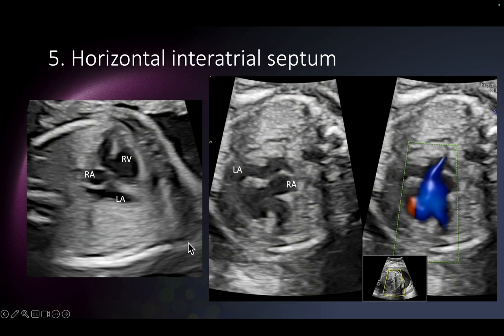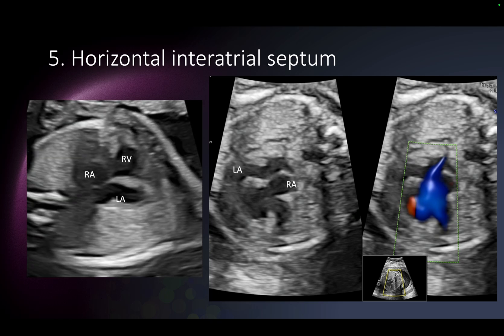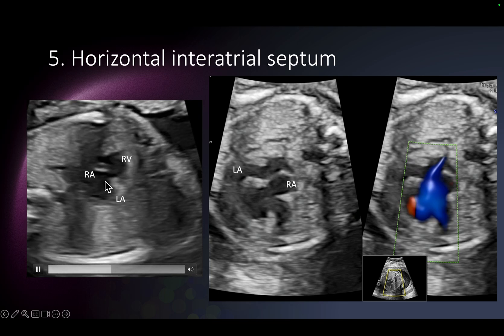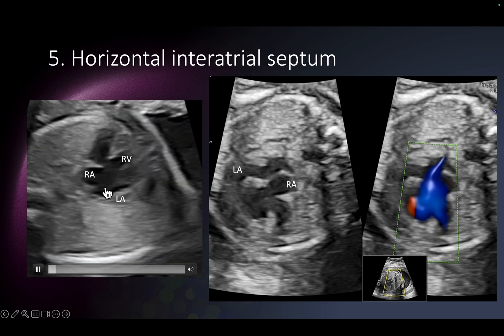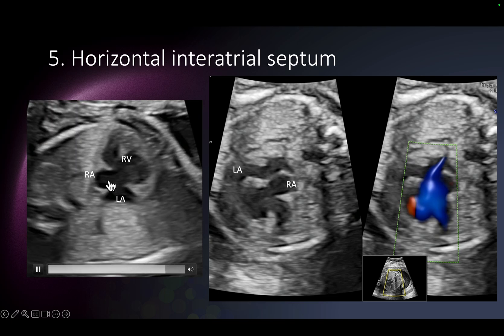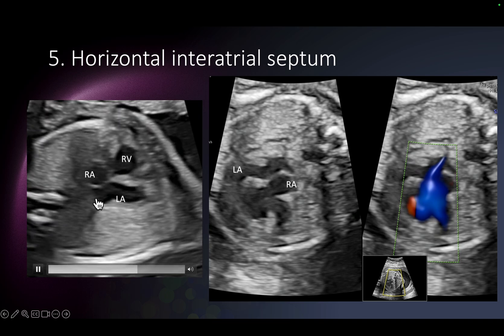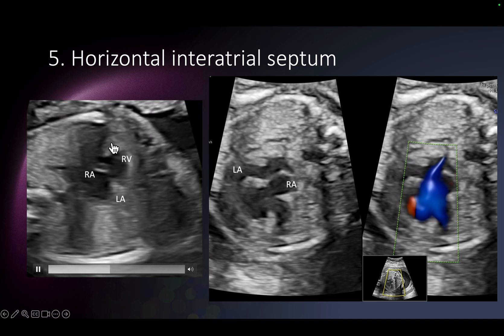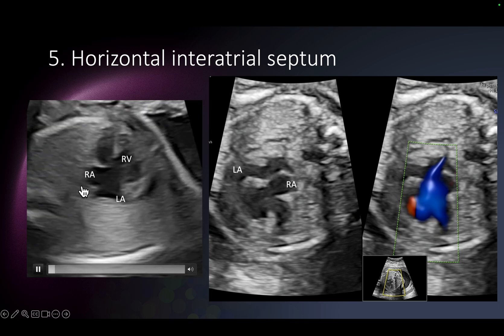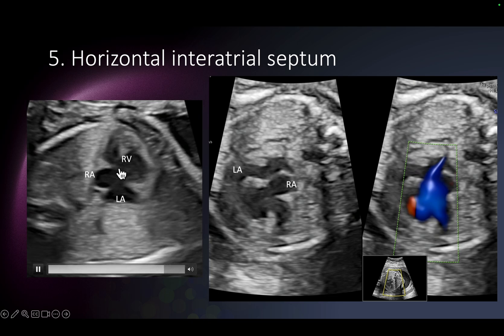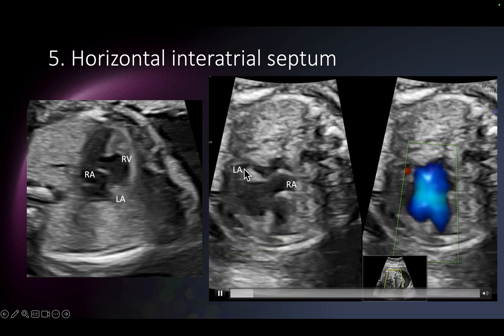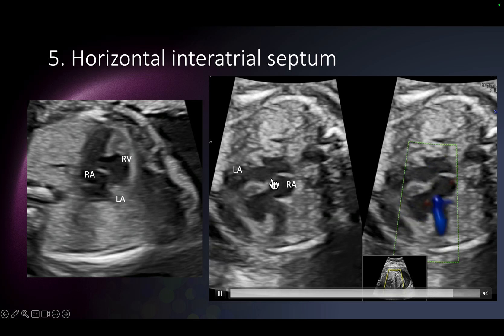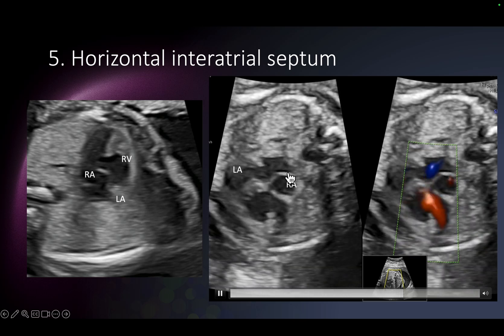Now let's look at another slide. You notice the septum is horizontal. What do I mean by horizontal septum? Look at this inter-atrial septum — the direction of the inter-atrial septum is on this side, while the inter-ventricular septum is almost at 90 degrees to the inter-atrial septum. In a normal fetus or normal child, you would see the inter-atrial septum almost aligned with the inter-ventricular septum. Here they are at right angles to each other.